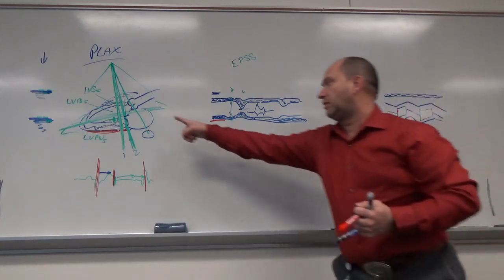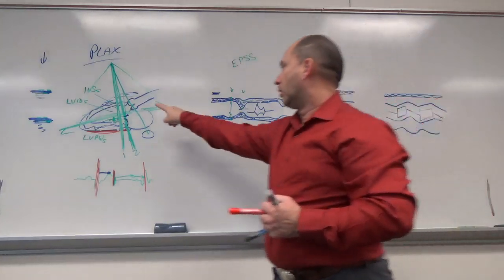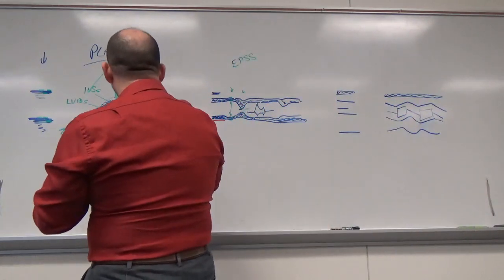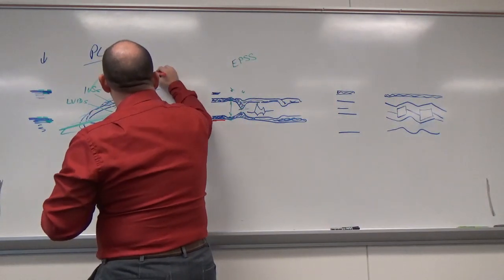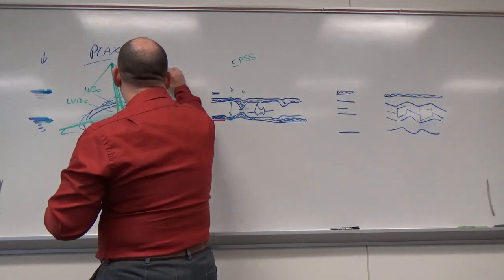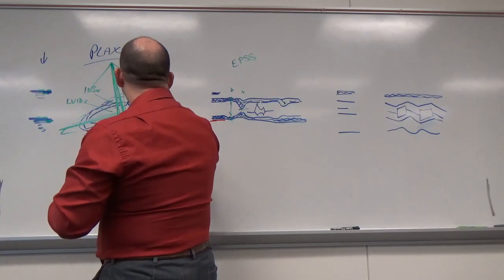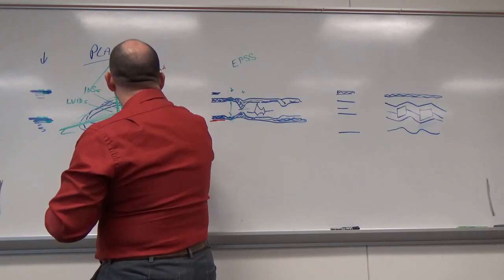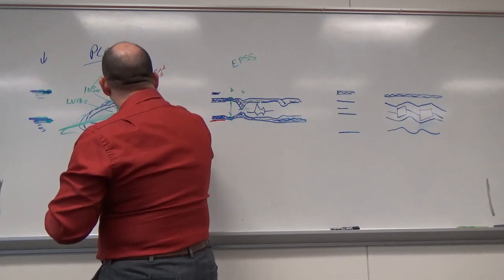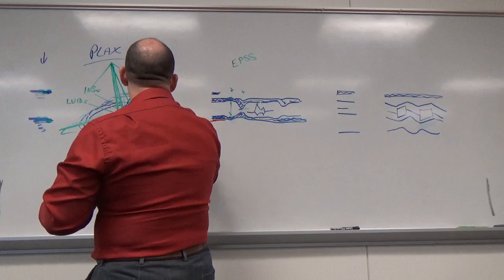Now we measure these in 2D also. We're going to measure the aortic root at end diastole, and the LA, which is going to be from there to there, at end of systole.